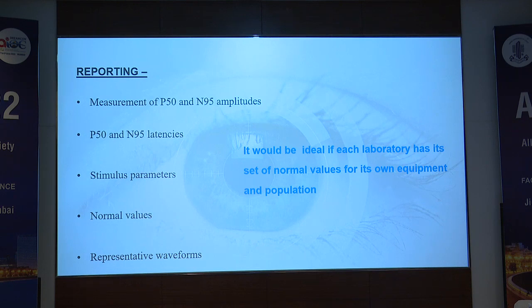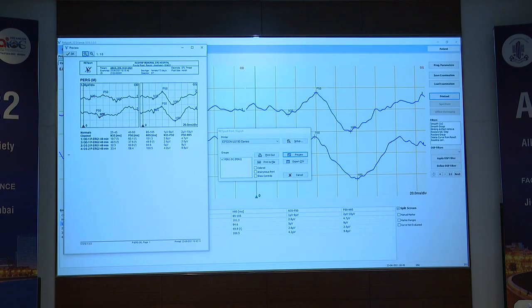So what all should the pattern ERG report contain? It should contain the measurement of amplitudes.